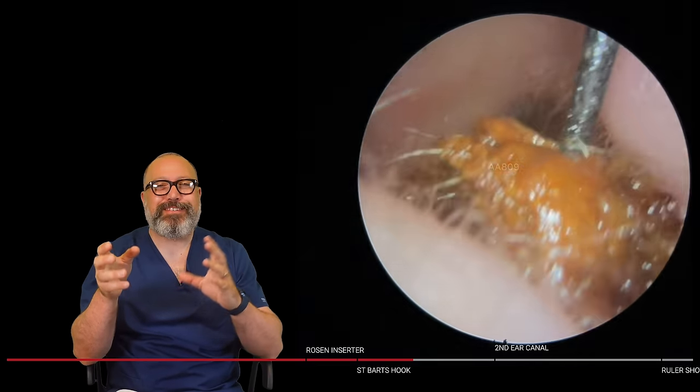The difficulty when you have these longer plugs, they can be a little bit more awkward to get out because of the natural bends in the ear canal. So these longer plugs do tend to form into that sort of gentle S shape sometimes. So as you're pulling on the front end, that rear end is holding everything in. It's still crumbling down this one as well. It's that more sort of dry and brittle type of wax here.